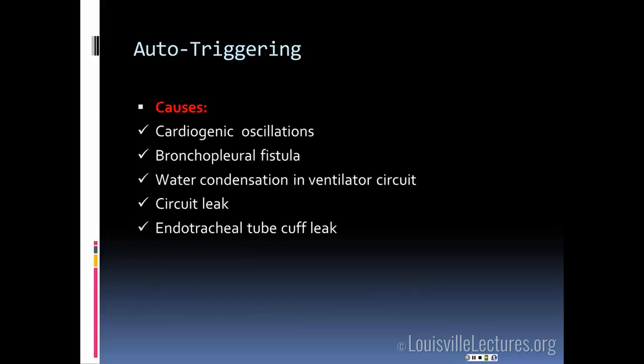Auto-triggering can be caused by cardiac oscillation, bronchopleural fistula, water condensation in the ventilator circuit, circuit leak, and leak of the endotracheal tube cuff.